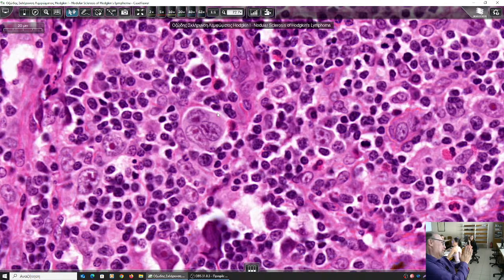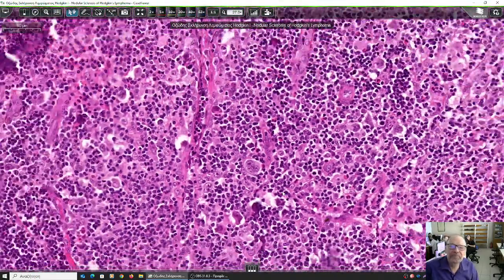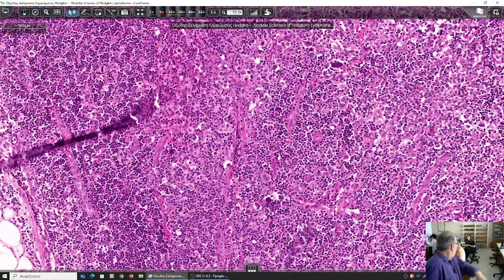Ah, thank God you put my name. That's right. We see there are three nuclei. I'm not wrong: 1, 2, 3. Anyway, I'll report it to the hematopathology division of pathology.